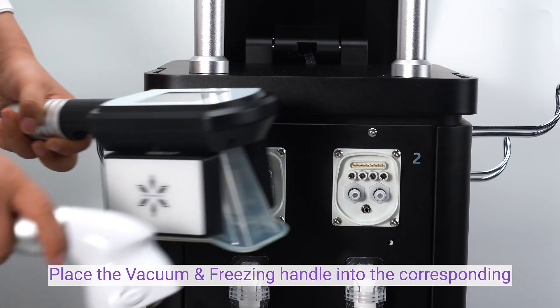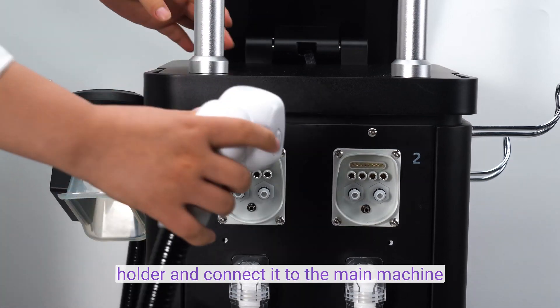Place the vacuum and squeeze the handle into the corresponding holder and connect it to the main machine.